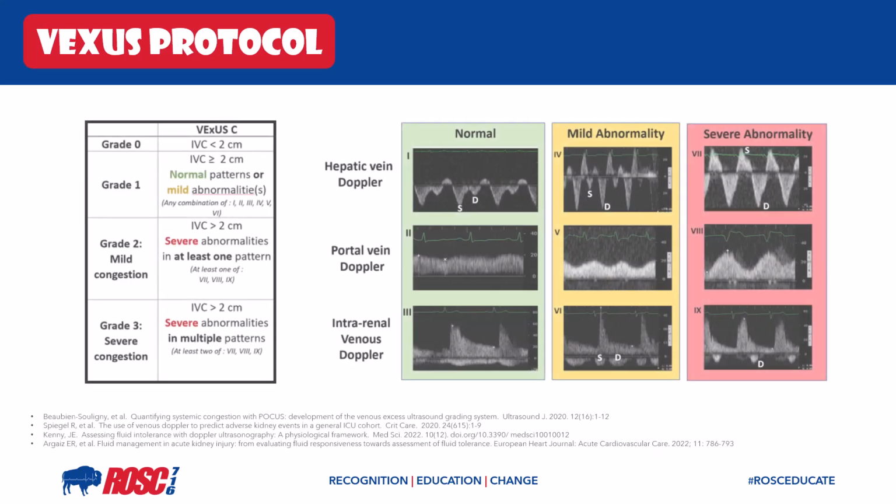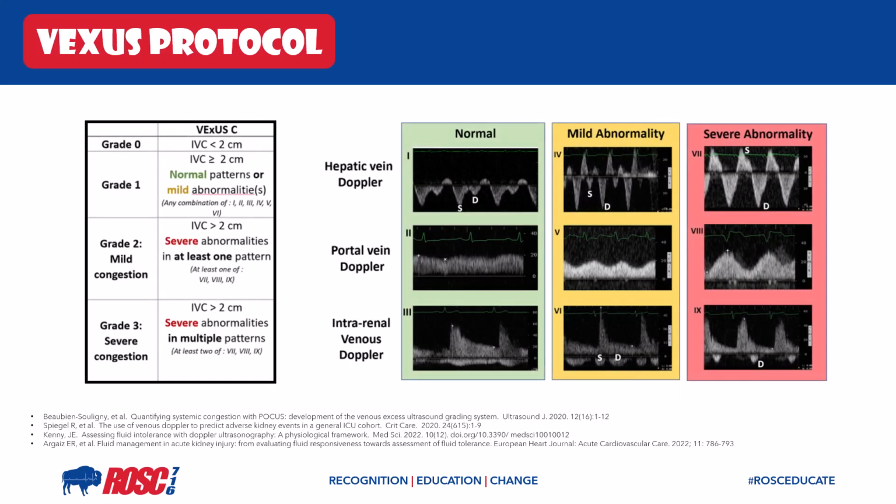So now let's tie together this protocol, this grading system. So before moving forward, again, as stated during the intro of this lecture, teaching the fine details of POCUS or the VExUS protocol are outside the scope of this lecture. I'm going to merely walk you through the process and logistics of the VExUS protocol. Image acquisition and interpretation definitely require additional training.